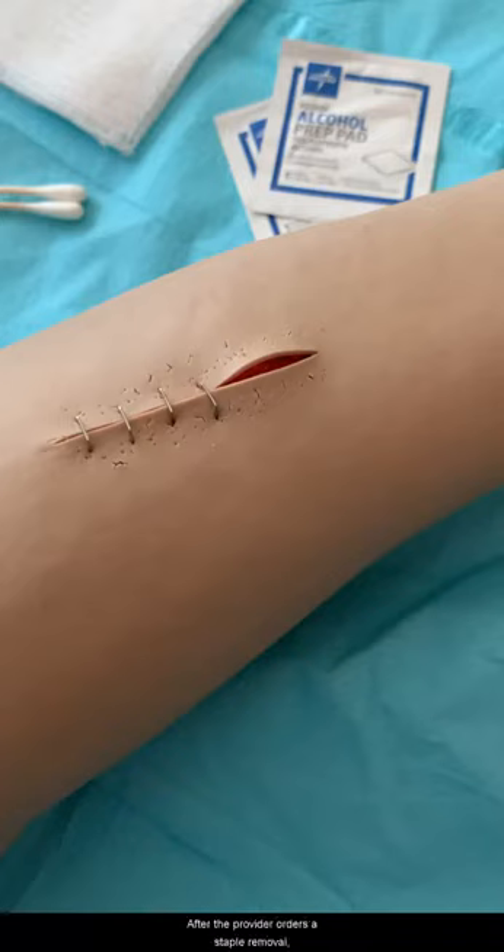After the provider orders a staple removal, open a sterile package containing the necessary instruments on the mayo tray and proceed.